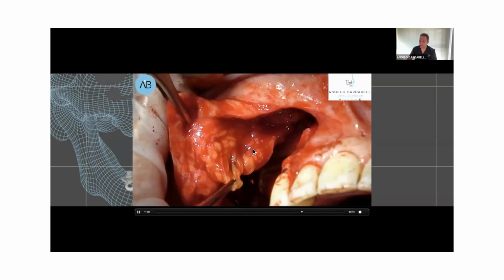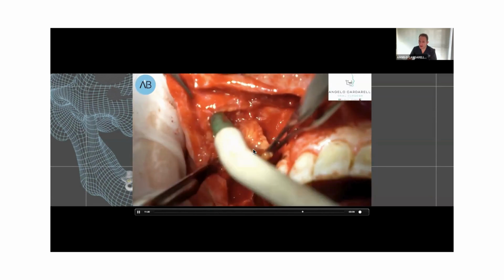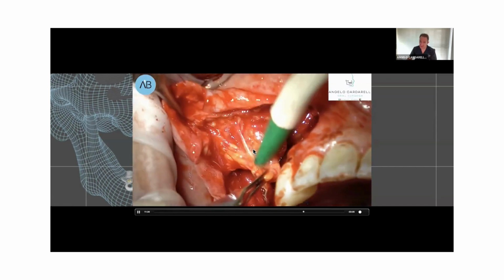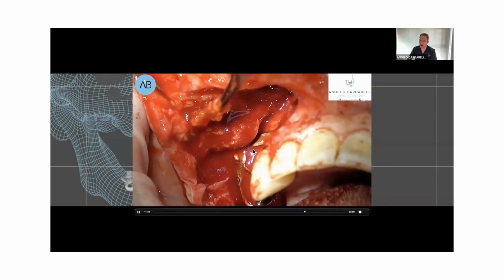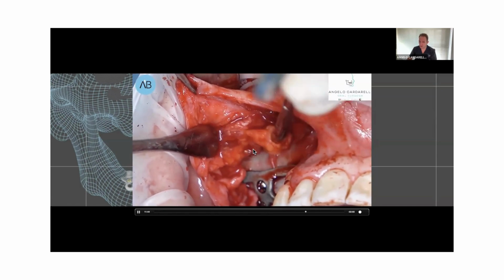No cutting, be careful, but just to release and to move on the top of the customized implant using a resorbable suture 4-0 to create a double layer. You can see the mobility of the fat.